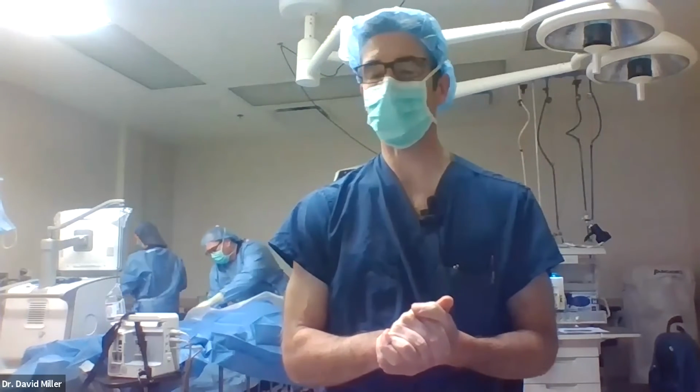Am I left-handed? No, I'm right-handed. I'm thinking where that question's coming from. It was a left eye. So yeah, I always start with whichever is on the temporal side. So I'll use my left or right hand fairly evenly throughout the case. And I guess I drained left-handed too. I drained the retinotomy site left-handed and I lasered left-handed. So you probably saw me going back and forth, left and right hand.